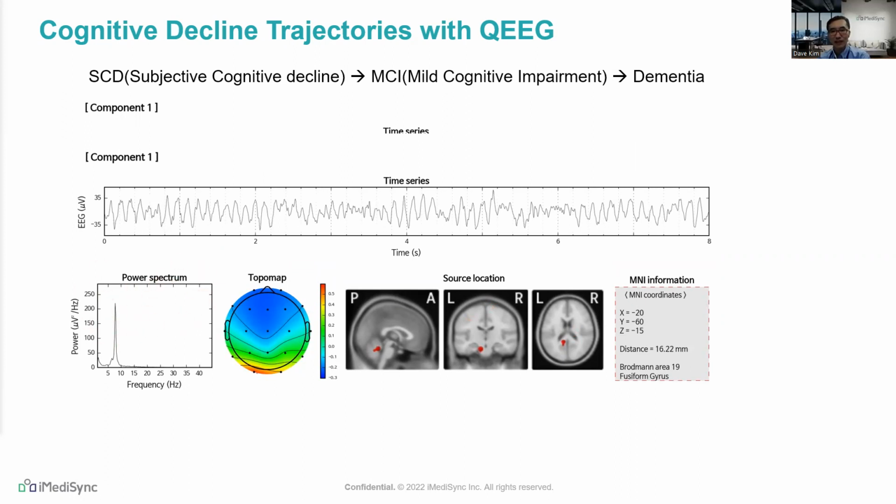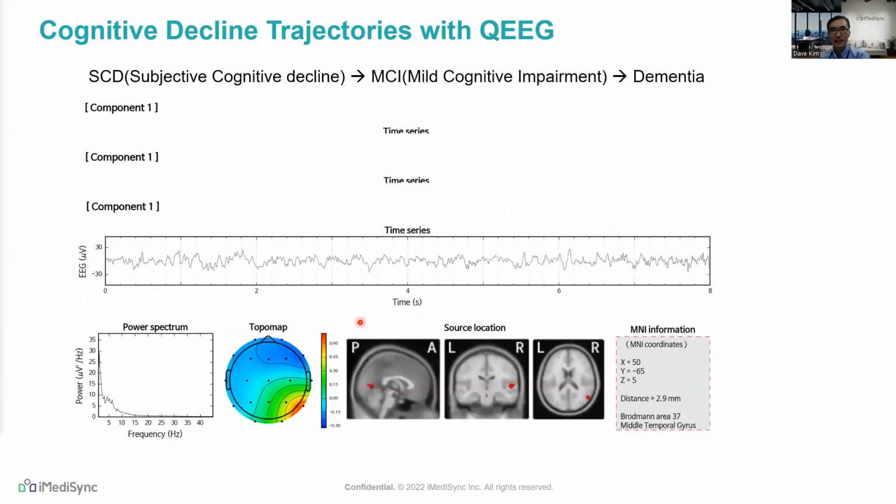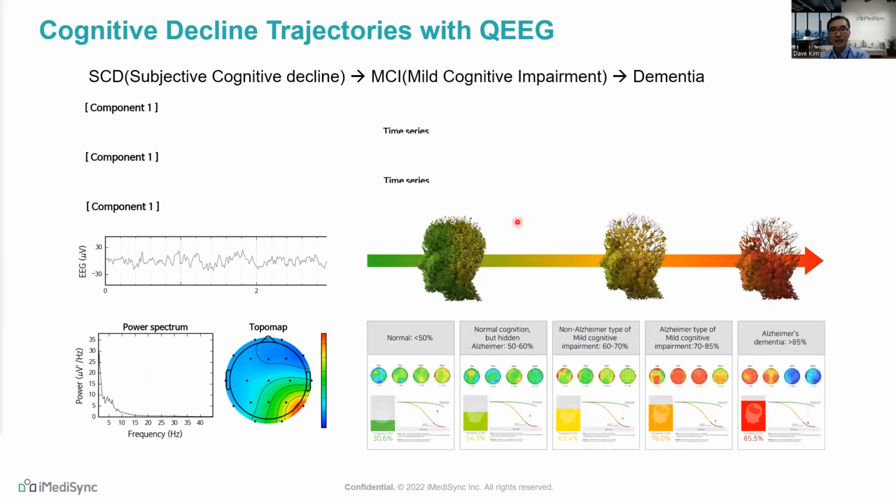The alpha frequency band is quite narrowed and far below from the 10 Hertz adult normal frequency. In the AD case, the first component is no longer alpha, but a slow component originating in this case in the middle temporal gyrus. Component information is very useful for understanding QEEG profile. iSyncBrain MCI classifier can also predict early stage of Alzheimer dementia using multi-level ensemble machine learning classifier.